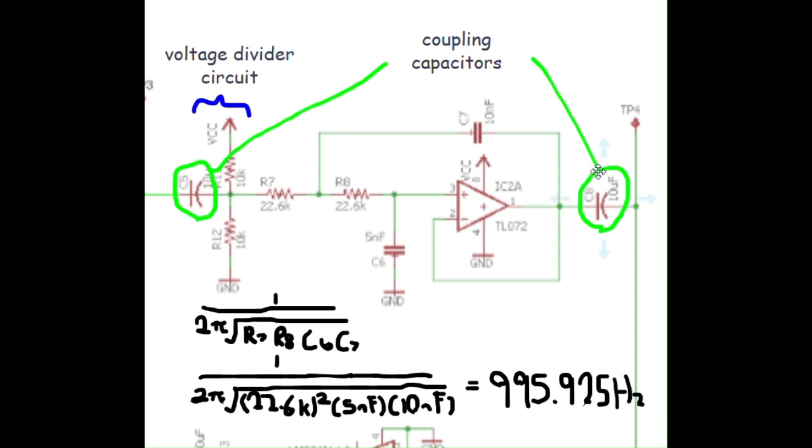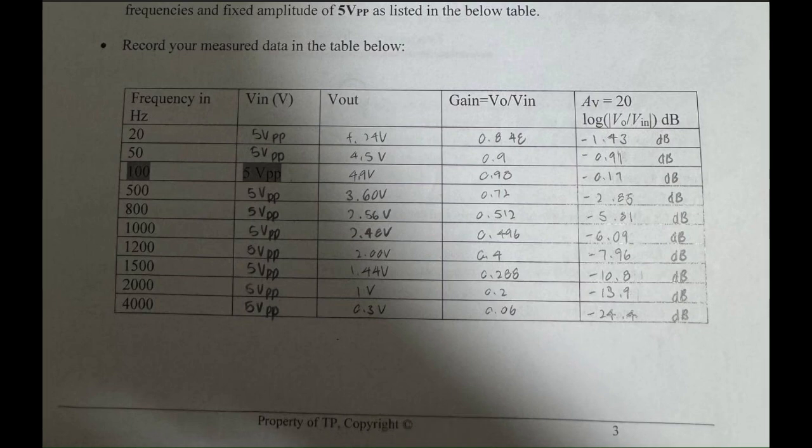These coupling capacitors are in charge of removing any DC offset from the previous block or from going to the next. This table below shows the output of the Sallen-Key second order low pass filter, and this is a section of the Vout, and notice when it comes to 1000 Hz, which is the approximate cutoff point for the low pass filter, it starts to attenuate. It starts rapidly going down in decibels also.